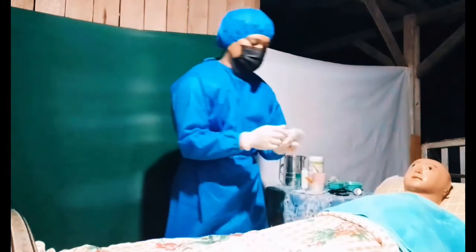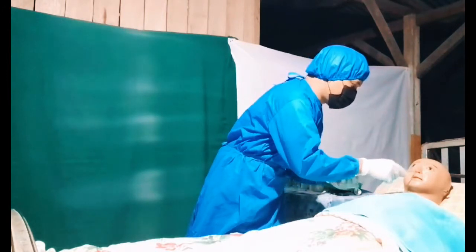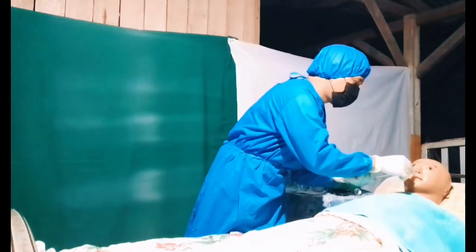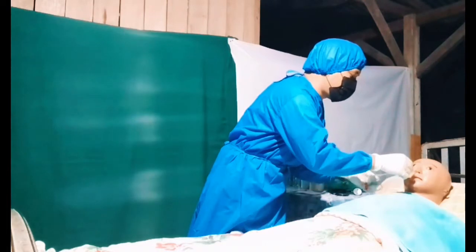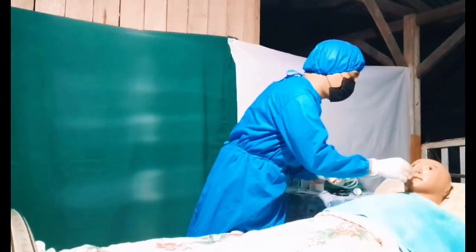Then, ma'am, I'm going to insert the tube. Kindly breathe with your mouth, right? And if you feel that the tube is in your throat, please kindly swallow. Swallow, right? That's right.